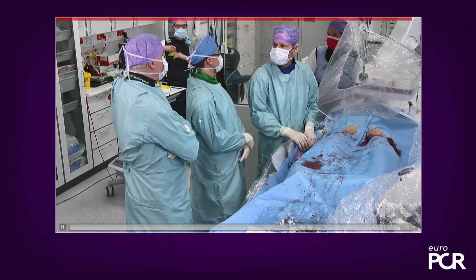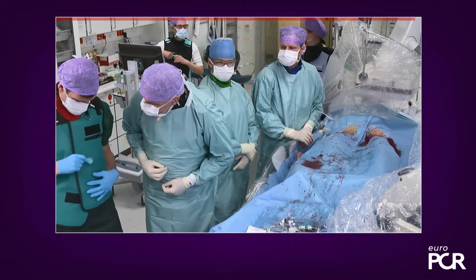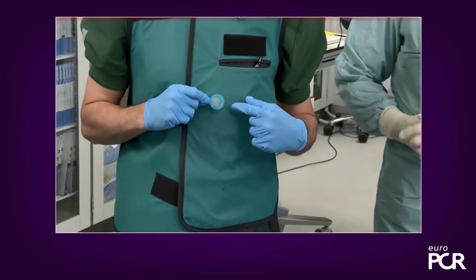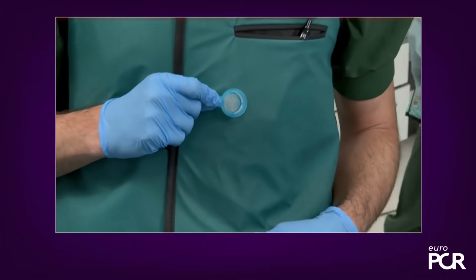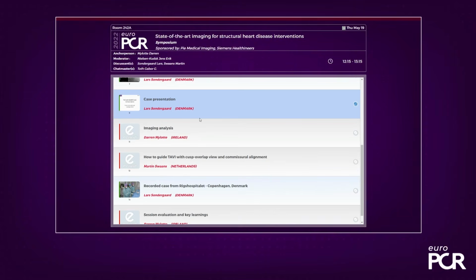We check. We normally don't check. Was anyone looking? You got it, yeah? All right. Yeah, that was quite a lot of debris. Can you zoom in here and film further in? I'm convinced sometimes that the companies give you guys little packets of stuff to put into the filter, so you can say, "Oh, look at this." I never see anything in my cases.